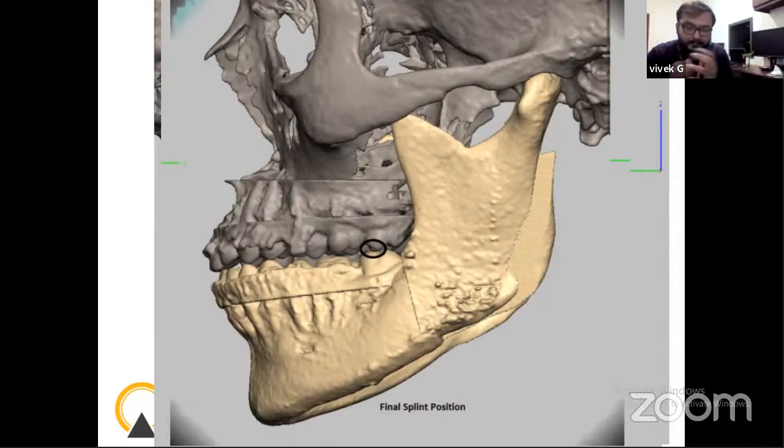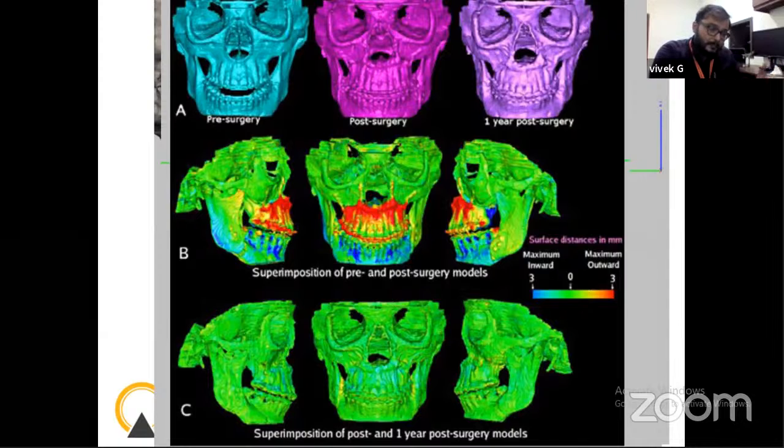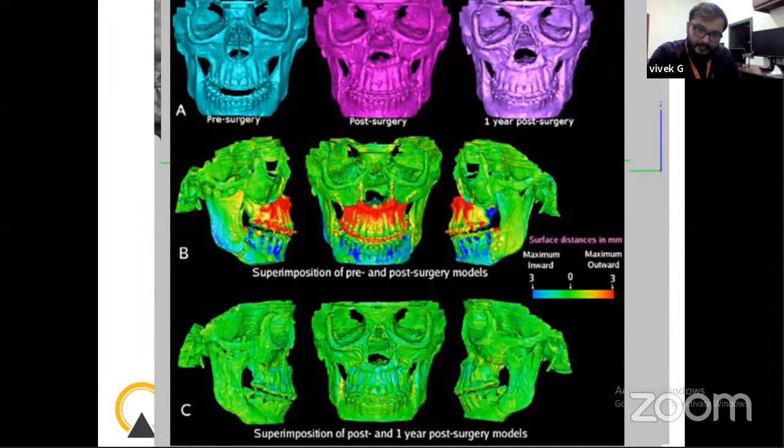So this is a very novel and wonderful application of CBCT again. I was always telling you that CBCT is usually done pre-surgery or pre-procedure for planning. But in certain cases, like in this orthognathic surgery case, we can always go in for a pre-surgery, and you can go in for post-surgery evaluation also. So CBCT can also be used as an evaluation tool in certain areas.